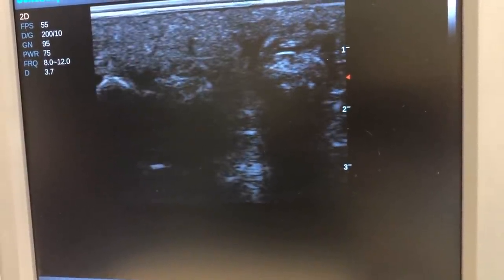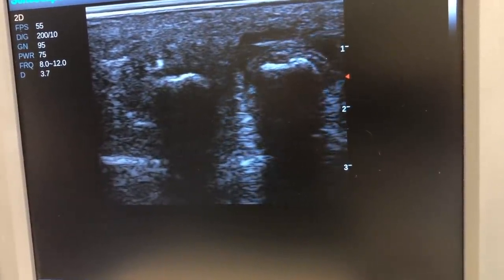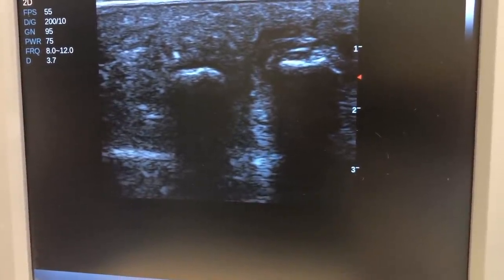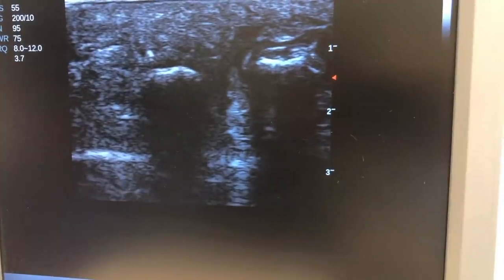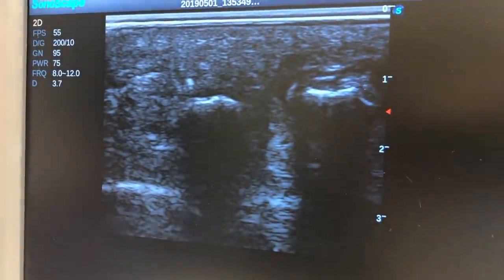What we're going to see here is the two white lines are the metatarsal heads. For her, it's the third and fourth metatarsal head. The black underneath them is actually the bone — the ultrasound doesn't penetrate the bone, so it's black. The black between the two heads — right in here — that's where the neuroma sits.